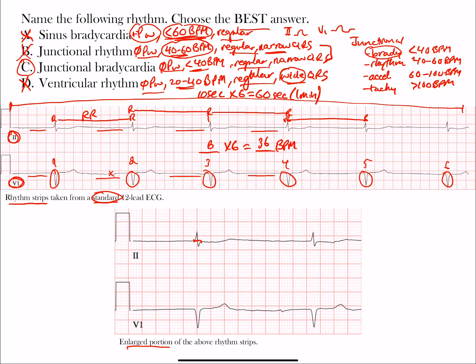Our strip fits the description of junctional bradycardia at 36 bpm. To separate it from ventricular rhythm: ventricular rhythms involve slow cell depolarization in the ventricles and delayed intraventricular conduction, which produces those wide QRS complexes — which we do not see here. So the best answer is junctional bradycardia. That's the end of this lecture; I hope you learned something.